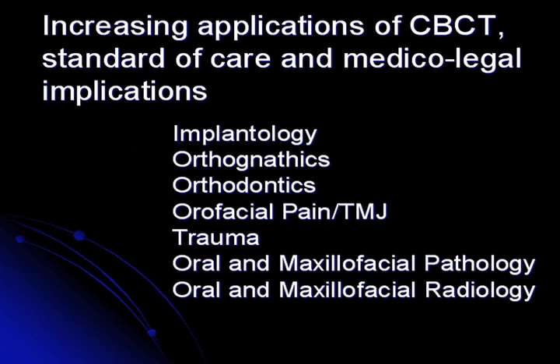And so the applications of CBCT are increasing right now in dentistry. And pretty soon it's going to become the standard of care for radiology and for radiographic diagnosis and treatment planning. And not just digital treatment planning for implants, but for a lot of disciplines right now.